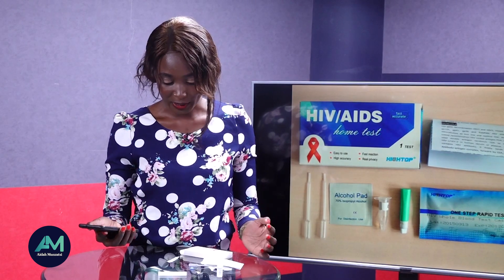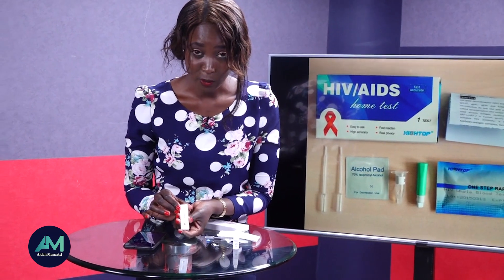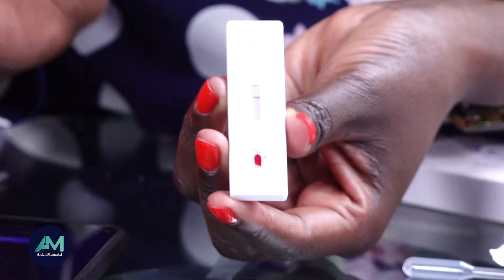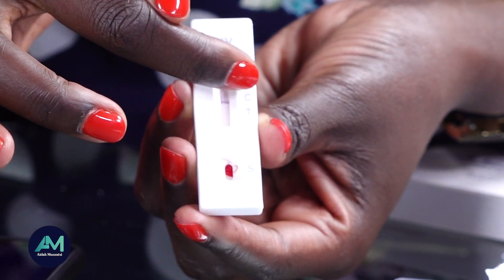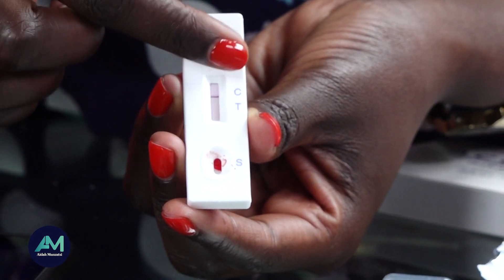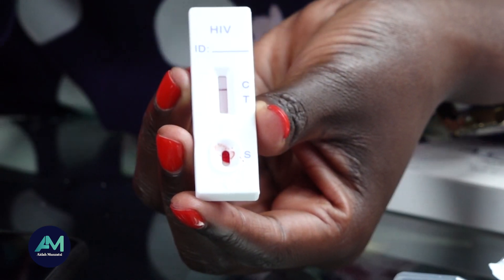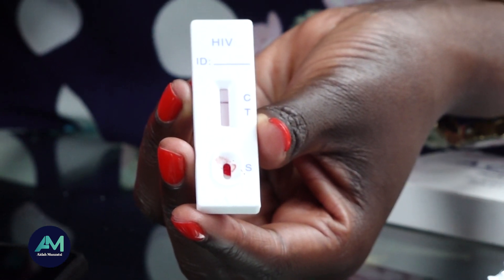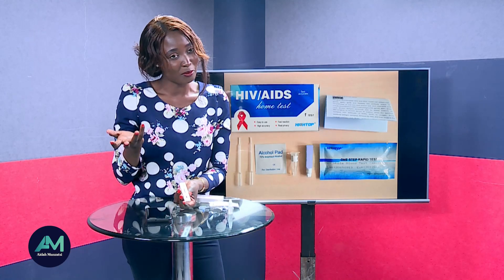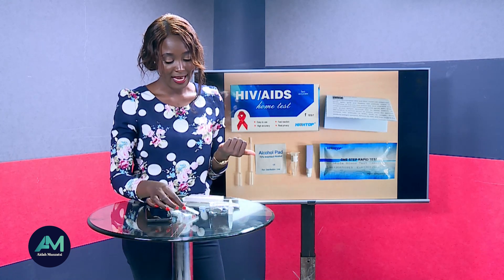It's done — these are my results. This means I am HIV negative. As mentioned: one line at C means HIV negative; two lines at C and T means HIV positive; one line at T means invalid; no line at all also means invalid. In the case of an invalid result, you'll need to go to an expert or professional for a proper HIV test.